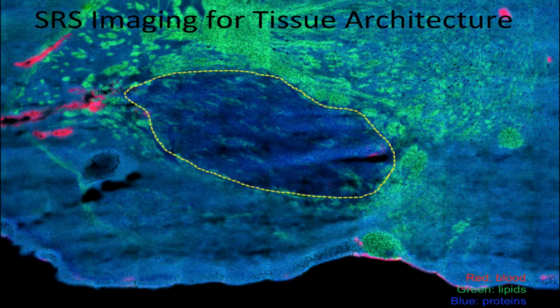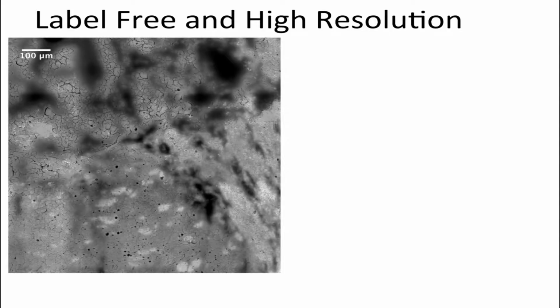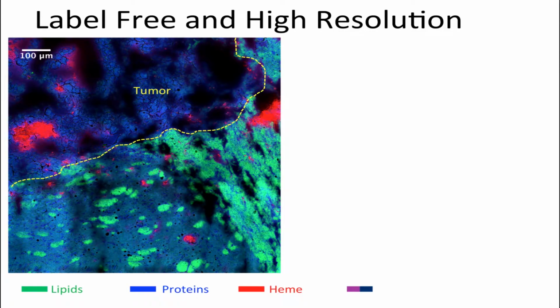And if we zoom in on some of those regions, this was just an optical image, we can overlay the tumor delineation with normal brain. And as it relates to H&E, we've developed software where we can co-register those images and validate what we're seeing with the SRS.